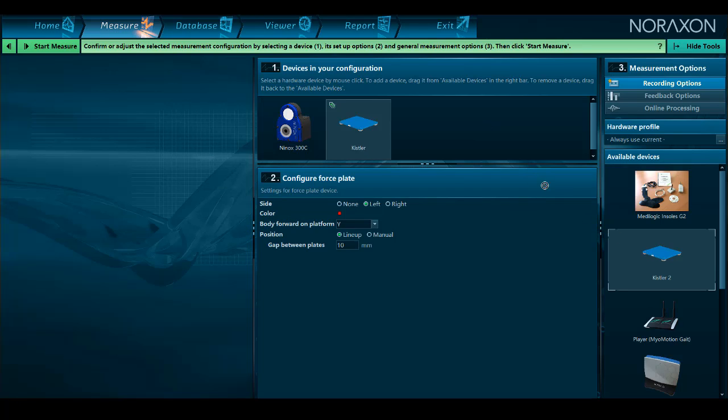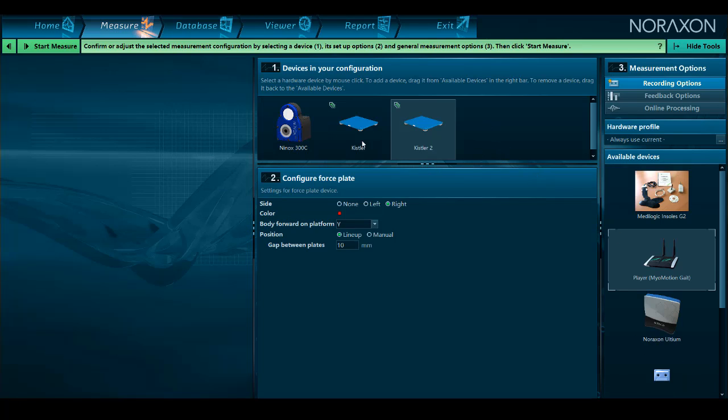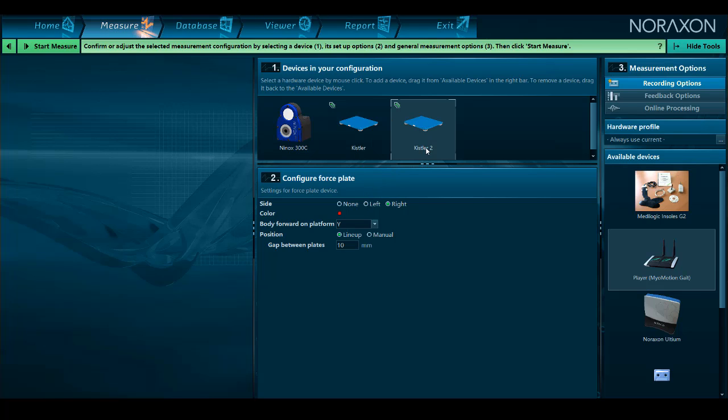For now, we will configure each plate as left or right but leave the body position as is and enter the measurement window.